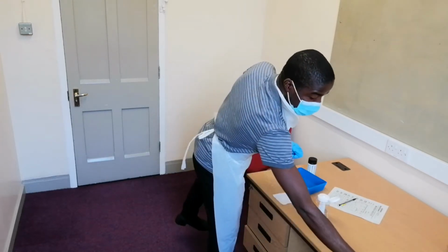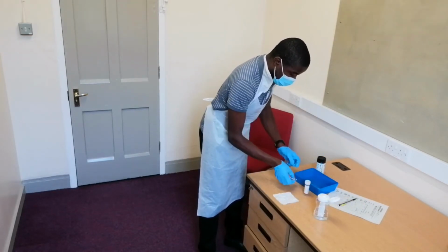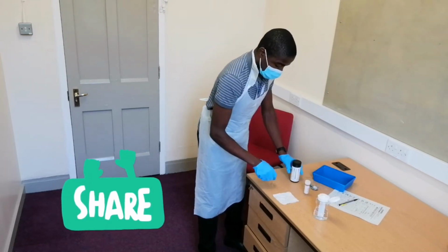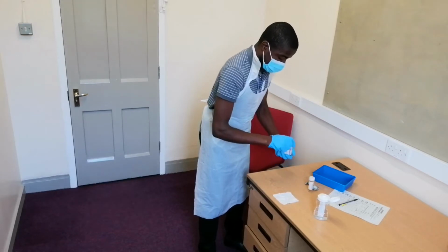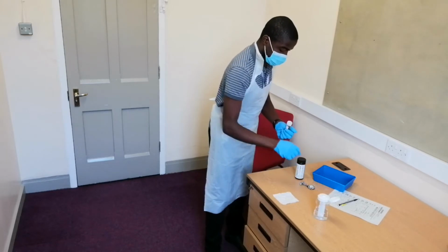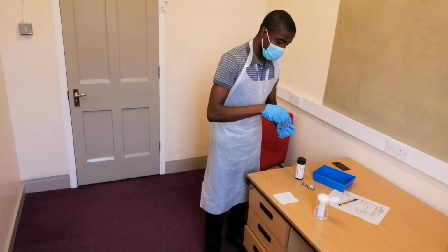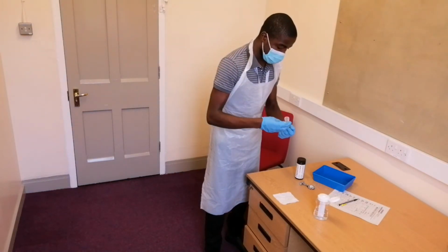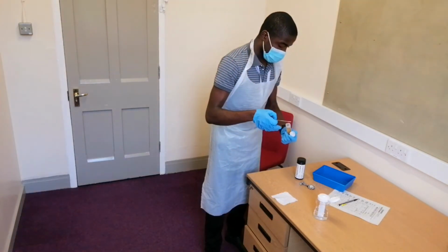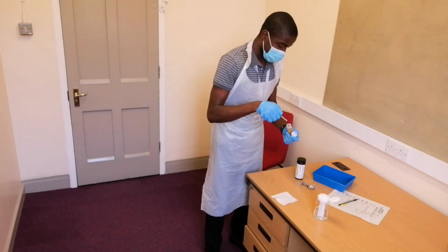Okay, now I have my sample from the patient and with the watch ready. And now be ready to dip my strip into the sample. Assessor, I'm going to dip the strip for less than 1 second. I open the sample without touching the inner portion, and I'm going to dip it for less than 1 second.